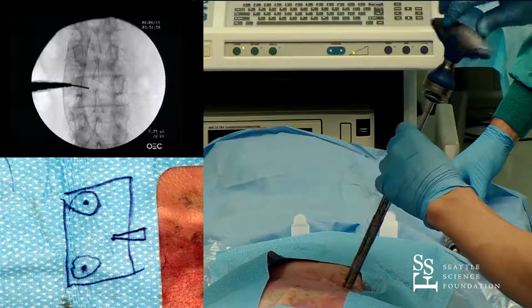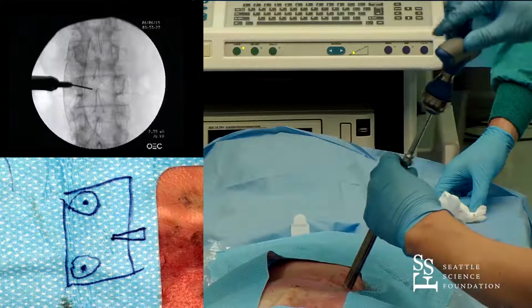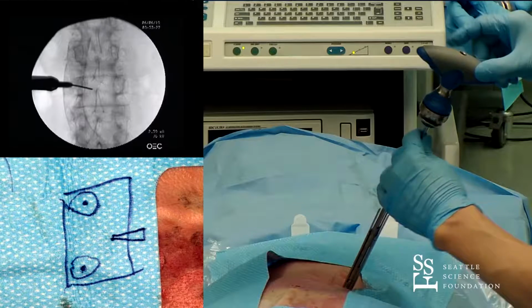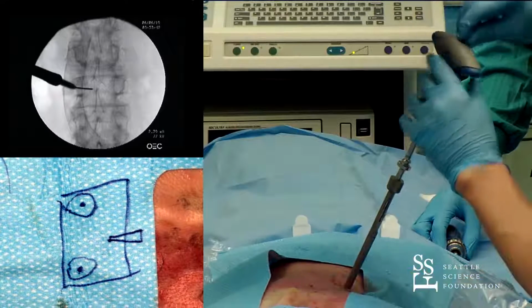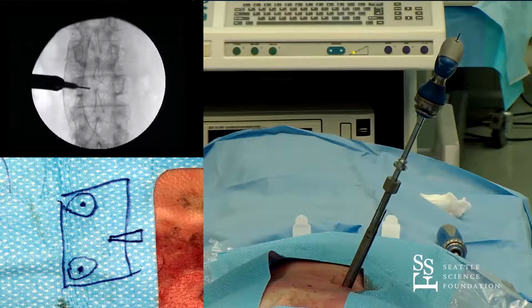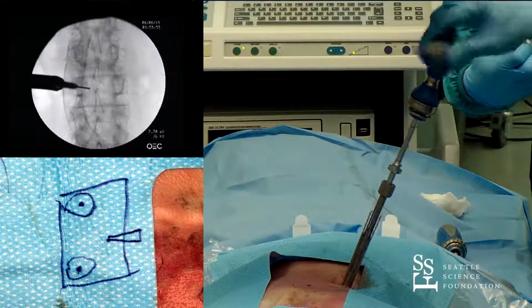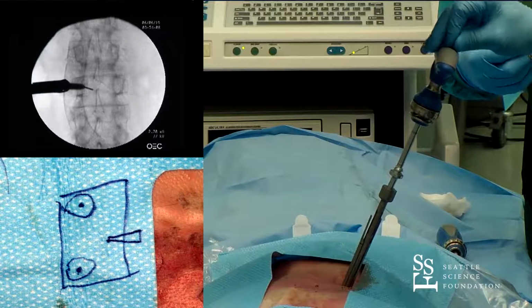Lost my guide wire. Shot. Okay, great. Oh, I see it. Okay. Shot. Great. Not bad. So basically, I'm just driving over the guide wire. Shot. Good. And you want to be collinear with that guide wire. So when you see the guide wire bend, it means that you're not collinear with the guide wire itself. Okay, shot. Beautiful.